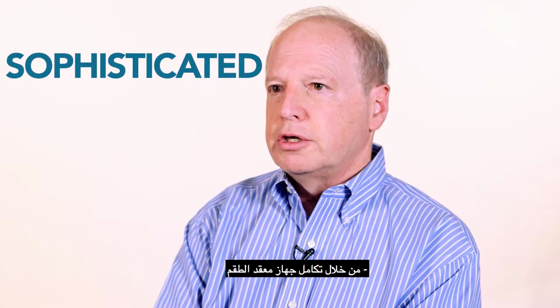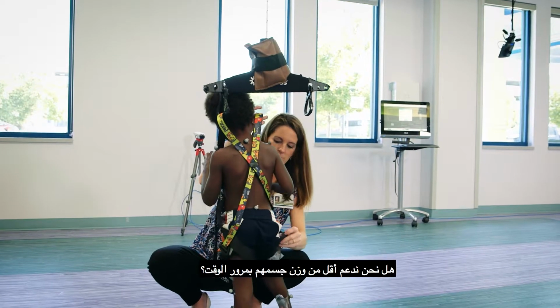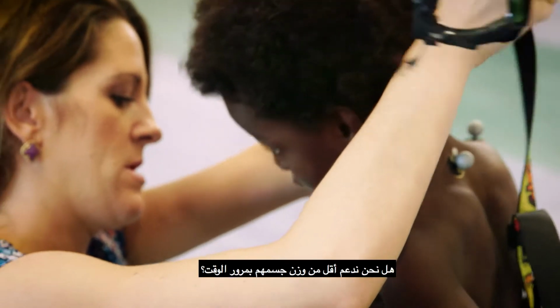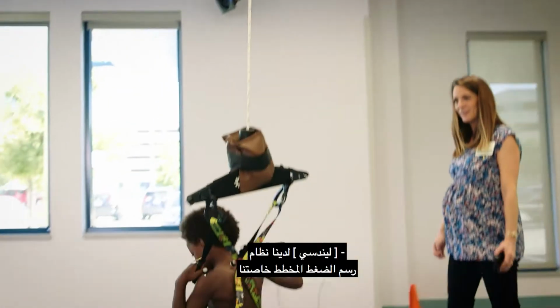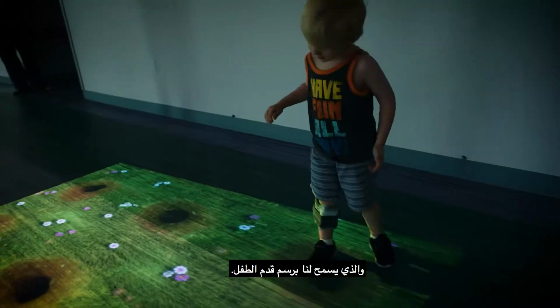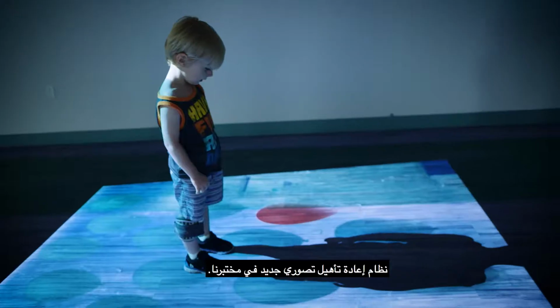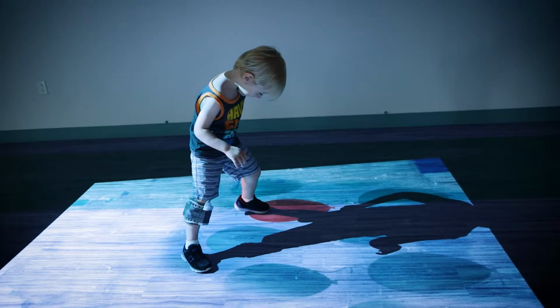By integrating a sophisticated harness device into the lab, with our interventions, are we supporting less of their body weight over time? We have our plantar pressure mapping system that allows us to map the child's foot. We have also incorporated a new projected rehab system into our lab.